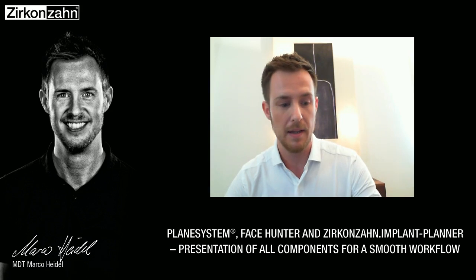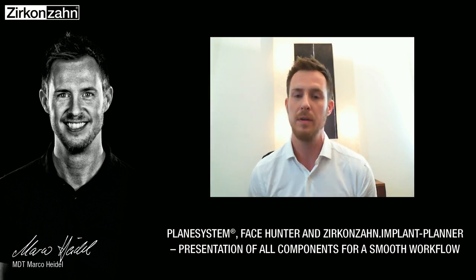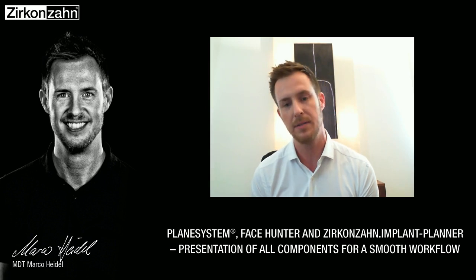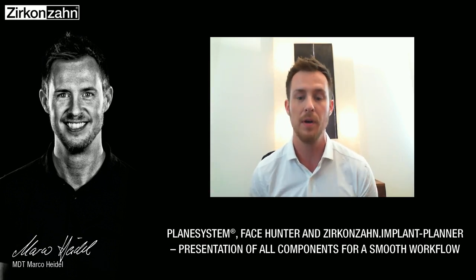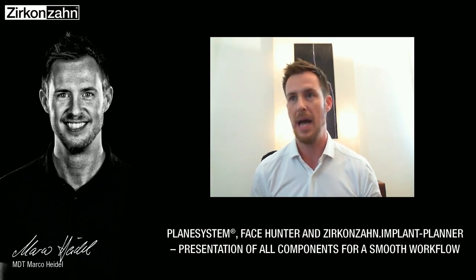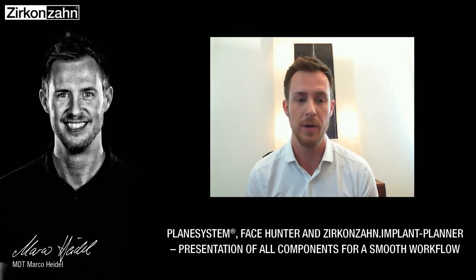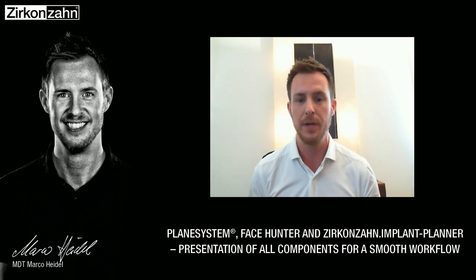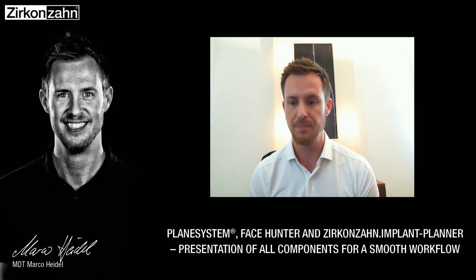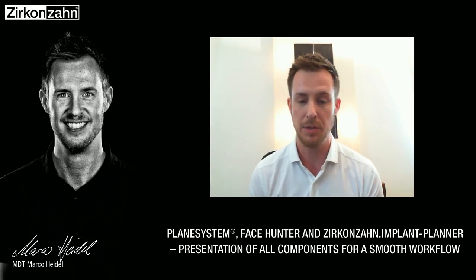This presentation builds on my last presentation last week. Whoever attended the last event knows a little bit about the digital workflow, using the Plane Finder and Face Hunter in the end to have all necessary data in 3D, to have the patient in 3D in your software to work with. Today we go a step further, and we concentrate on the immediate loading workflow. A part of last week we will see this time as well, but most of the stuff is new for you.